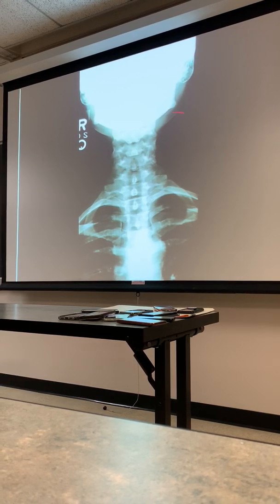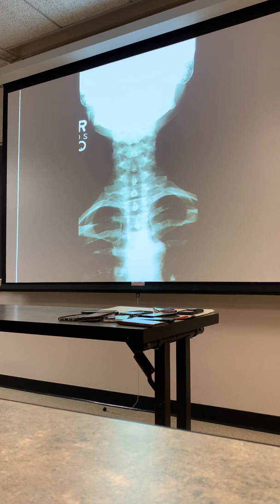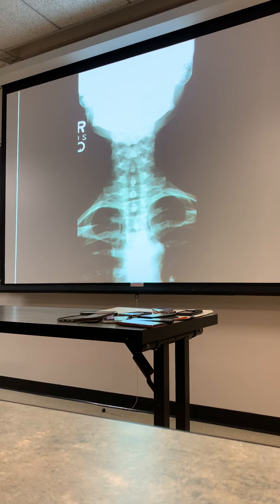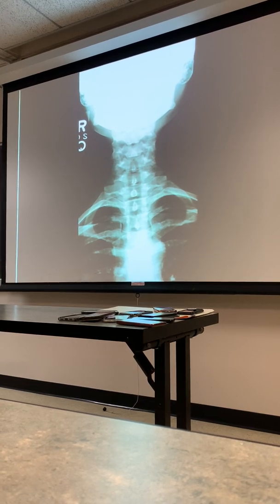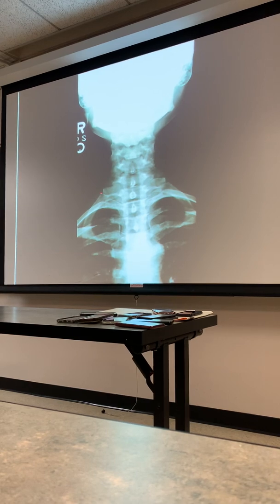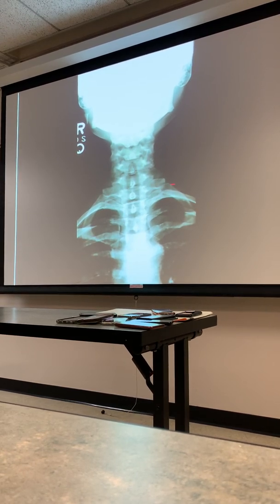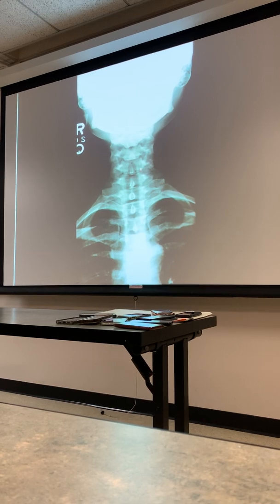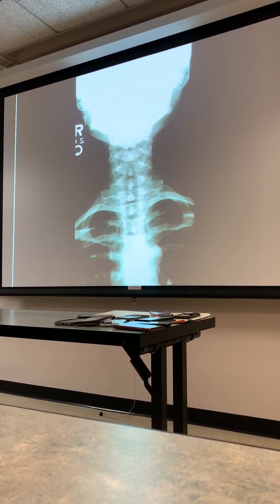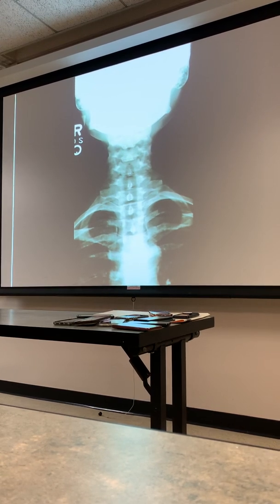All right, so we see the mandible. Here's the skull here, because these are, what are these? Those are the mastoid processes. So we know the skull is up in here, even though it's too bright, and I can't get it any darker. But we see the mandible here covering up. Actually, we only see, so here's the last rib is here, so that's T1, 7, 6, 5, 4. We don't even see 3 on this one. What should they have done? They should have lifted the chin up a little bit. Maybe they didn't angle either. They might not have angled to get up underneath there.